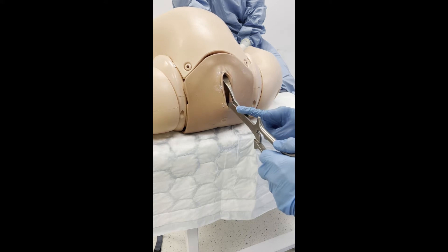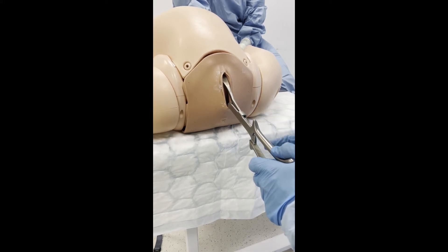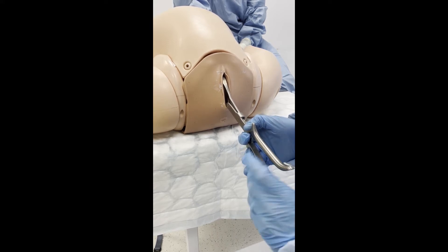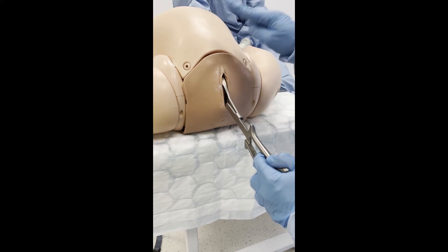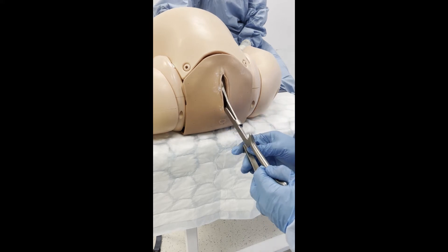After both blades have been applied, check that their position relative to the suture lines is correct. This is an LOT position, so the fetal head will require rotation in an anti-clockwise direction to OA. Asynclitism is corrected by the operator pulling the finger guard nearest the perineum towards themselves, while simultaneously pushing on the opposite finger guard. This is done until the handles are aligned.